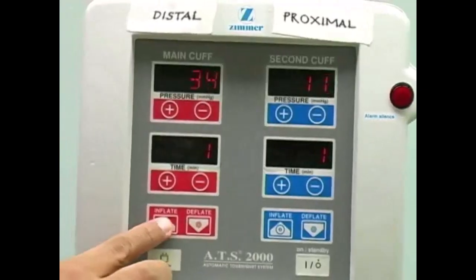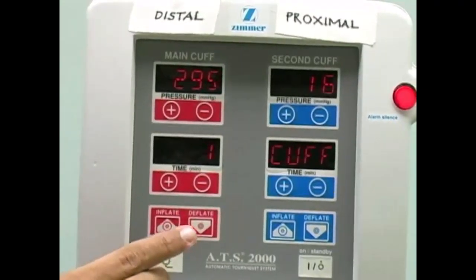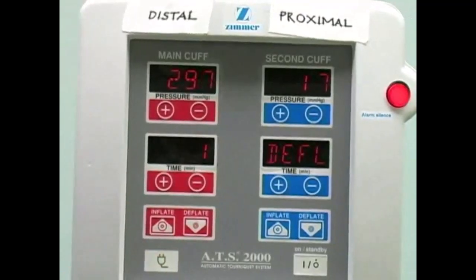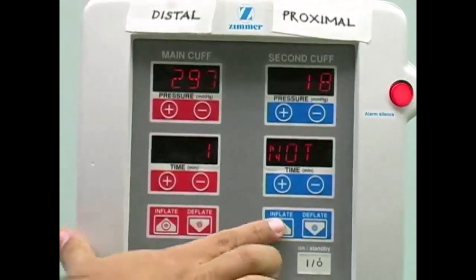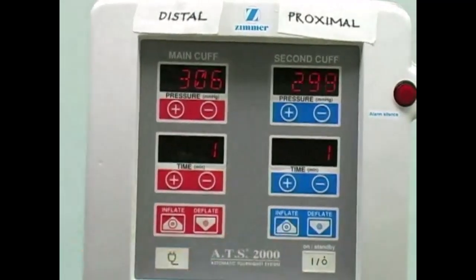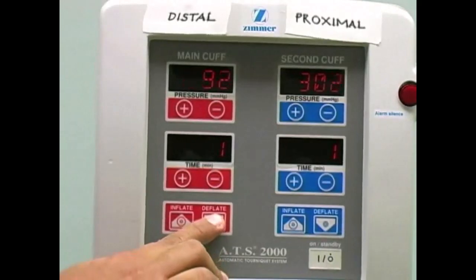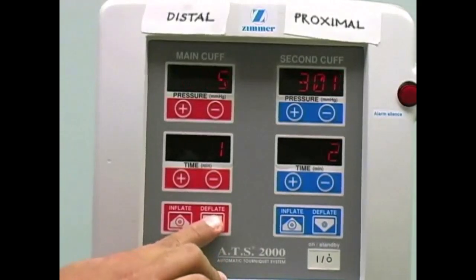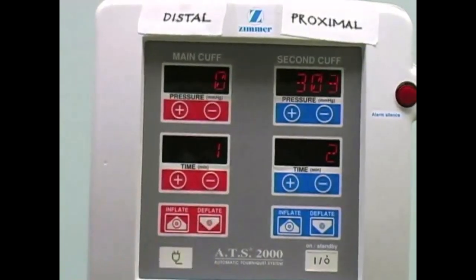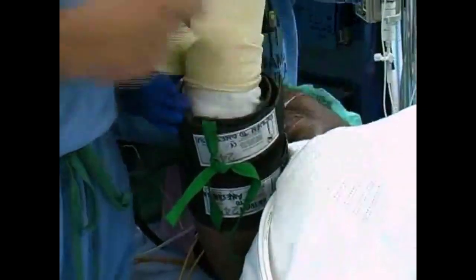Ask your assistant to inflate the distal tourniquet cuff to 100 millimeters of mercury above the patient's baseline systolic pressure. To complete exsanguination, inflate the proximal cuff. When the proximal cuff is completely inflated, deflate the distal cuff. When the proximal cuff is inflated, unwrap the Esmarch bandage.